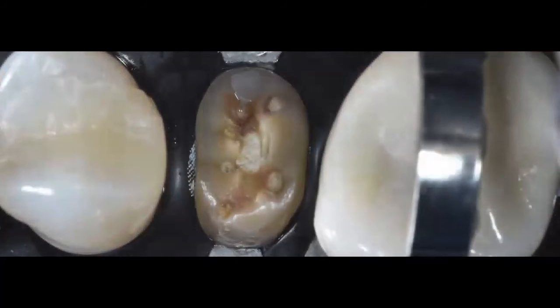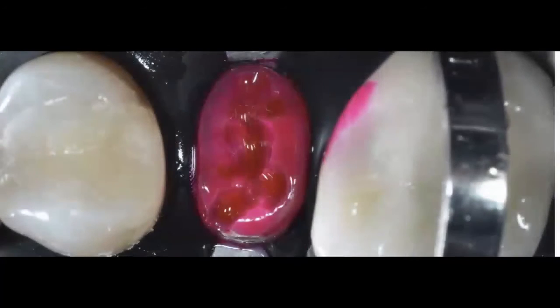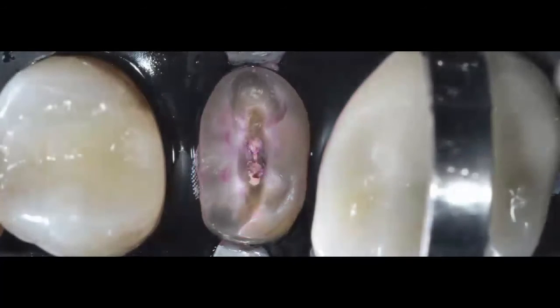So the first thing you got to do is isolate. You got to make sure that you can place a rubber dam, that you can invert your rubber dam underneath the sulcus, so that you have really good clean access to the fractured tooth. You can see also the temporary cement left behind by the endodontist, and I think that there was also a cotton pellet in there. So what I did is I removed that temporary cement. I went ahead and applied my caries detection dye, just to make sure that I had a nice clean peripheral seal zone. You can see that there was a little bit of decay still around my peripheral seal zone.